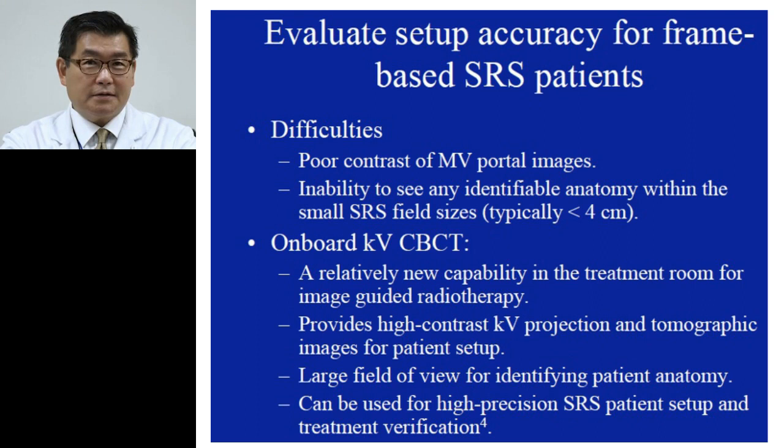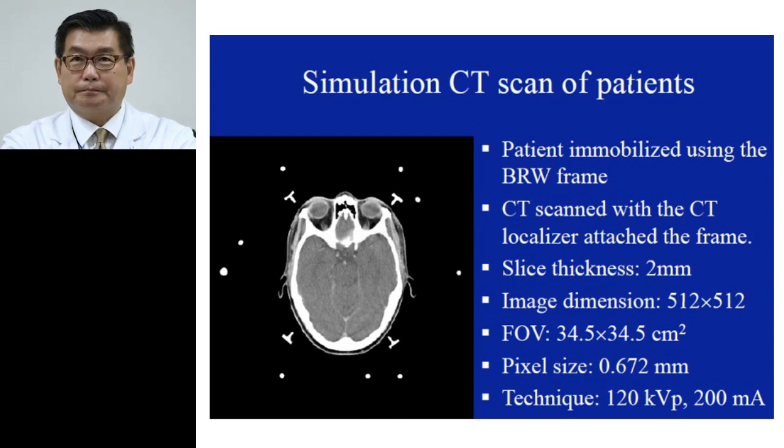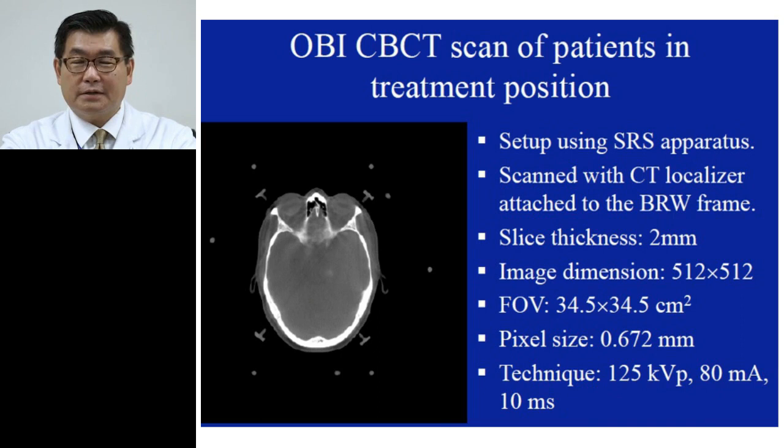has often been assumed. So we did a simple little study looking at patients who were being treated with a frame-based approach and did cone beam imaging of them at the time of treatment to see if there are any changes from the original simulation CT positioning and the positioning noted at the time of treatment in the same patients on the same day of treatment. So here, for example, is the cone beam CT with the fiducial localization rods in place, and were very helpful for comparing the reference image, the simulation CT, with the treatment image, the cone beam CT.